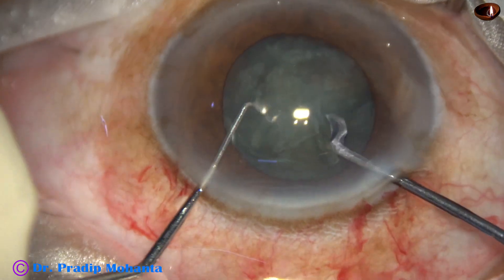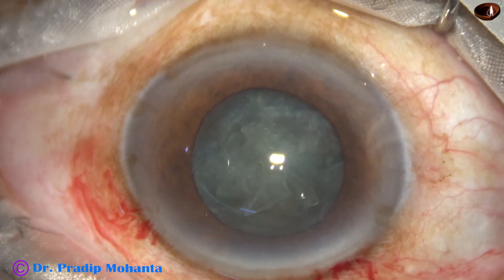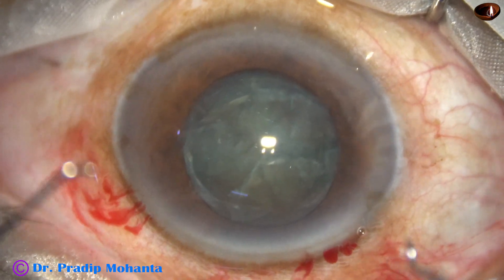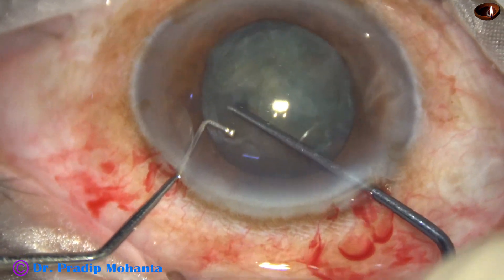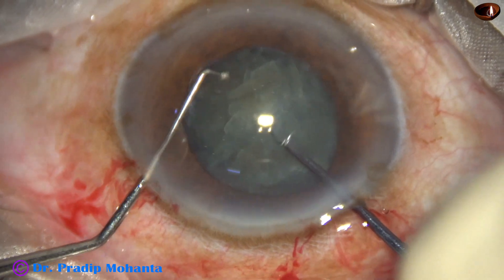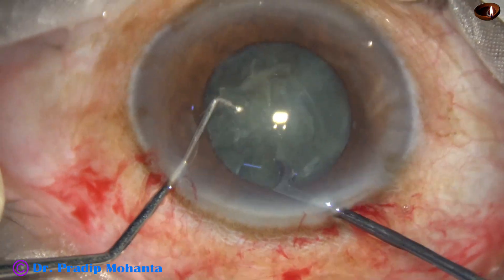After dividing one hemi-nucleus, I find that the anterior chamber is shallow. So I come out, inject some viscoelastic, and go again. I then turn the nuclear mass and this hemi-nucleus is also divided into two pieces.